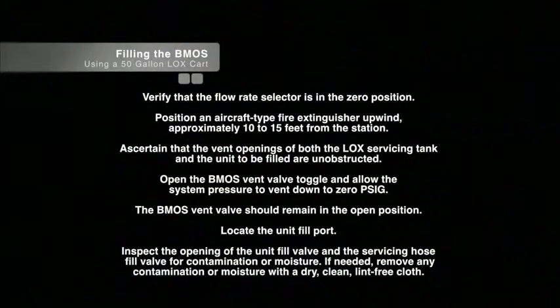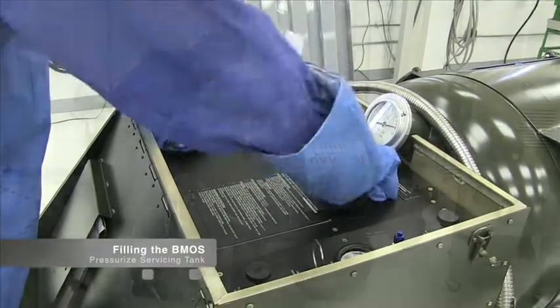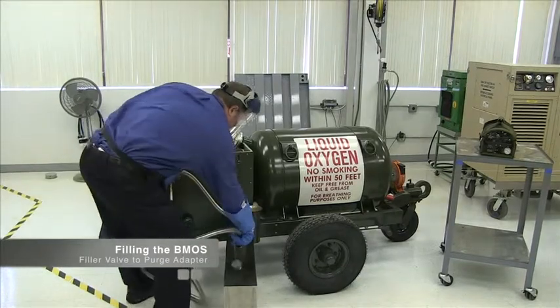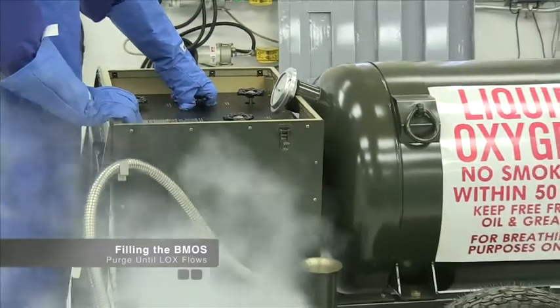Verify that the flow rate selector is in the zero position. Position an aircraft-type fire extinguisher upwind approximately 10 to 15 feet from the station. Ascertain that the vent openings of both the LOX servicing tank and the unit to be filled are unobstructed. Open the BMOS vent valve toggle and allow the system pressure to vent down to zero PSIG. The BMOS vent valve should remain in the open position. Locate the unit fill port. Inspect the opening of the unit fill valve and the servicing hose fill valve for contamination or moisture. If needed, remove any contamination or moisture with a dry, clean, lint-free cloth. Pressurize the LOX servicing tank to 35 plus or minus 5 PSIG in accordance with its instructions. Connect the filler valve on the servicing hose to the purge adapter on the side of the LOX servicing cart. Purge the servicing hose until the liquid oxygen flows. This purging procedure should be accomplished before any unit is filled.